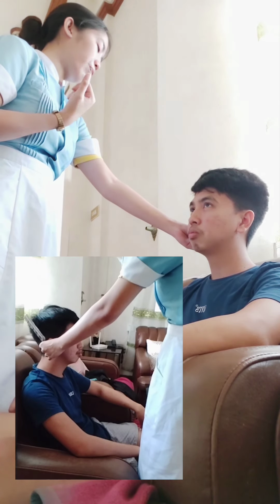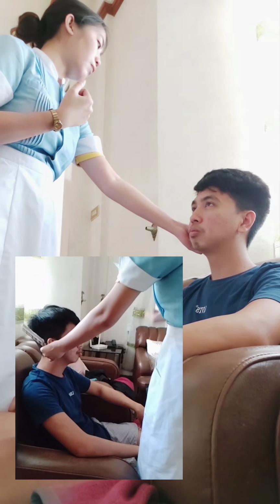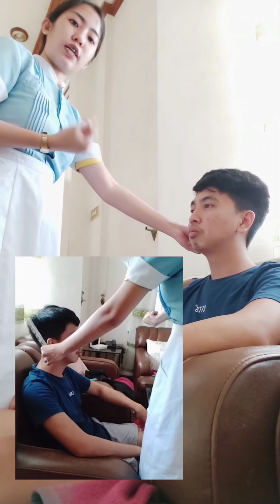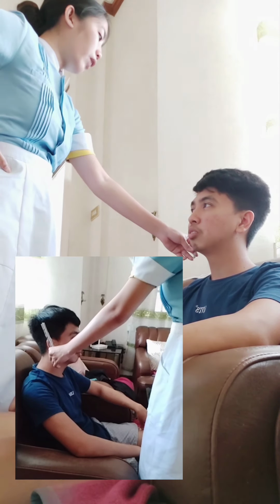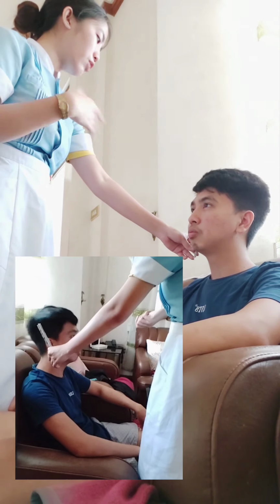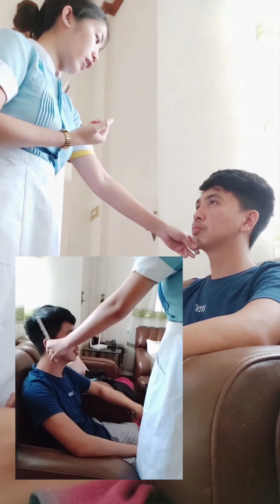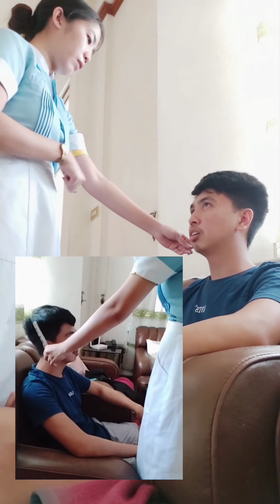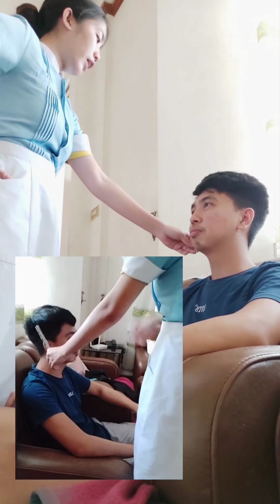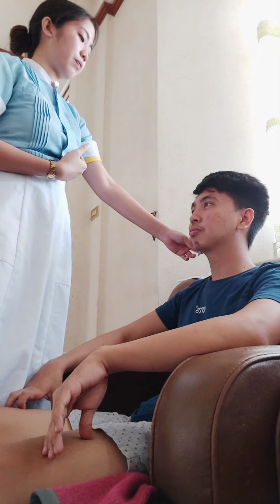Then next, promptly lift the fork off the mastoid process and place the vibrating tips about 1 centimeter from the external auditory meatus. Now I'll move the tuning fork next to your ear canal. Can you signal me again if you no longer hear the sound? Is that okay with you? Yes. Okay, then now I will record the length of time you hear each sound.